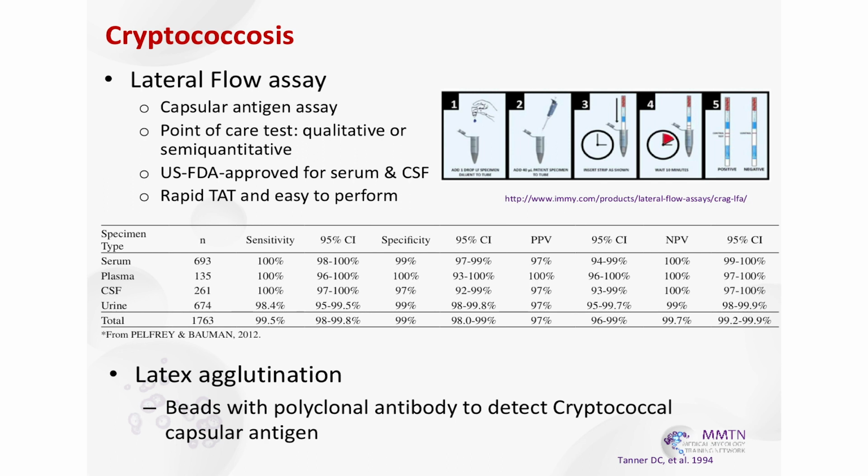Now it takes just less than 15 minutes. It's already POC, point of care. LFA actually doesn't involve anything. I just saw this this morning. What is LFA? Dr. Sun is sleeping. Dr. Sun, wake up. It's a lateral flow assay, right? It's very fast, 15 minutes, and it can show you the control and also the positive band.